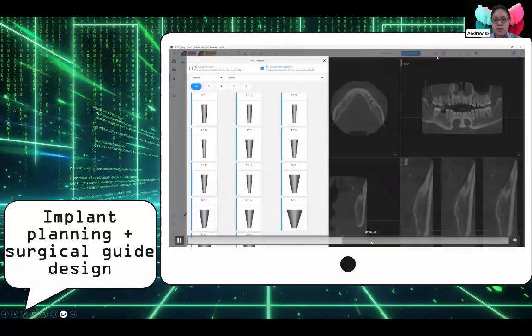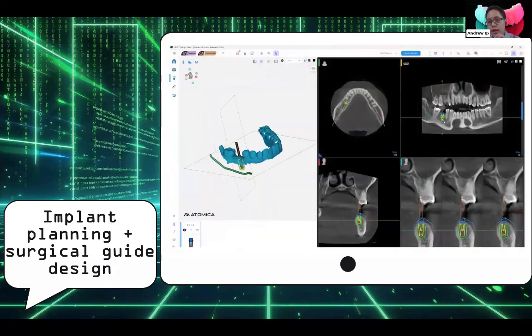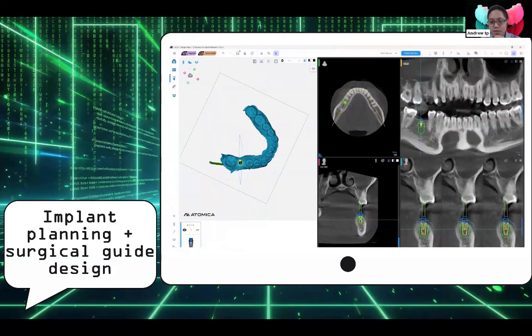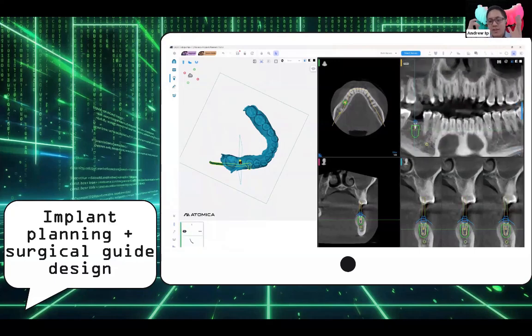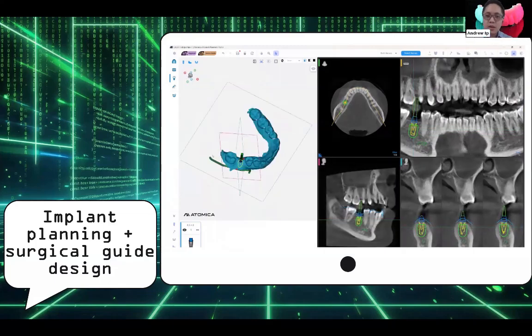All right, so here we're basically placing our implants. Of course, try, because this is a Try webinar. And as I said, all your fixtures are already there. Plonk it in. Of course, you have the option of letting the software plonk it where it feels it's the right place. But sometimes I like to have a bit of control in the situation. Yeah, you can try it, but I would never fully trust it.